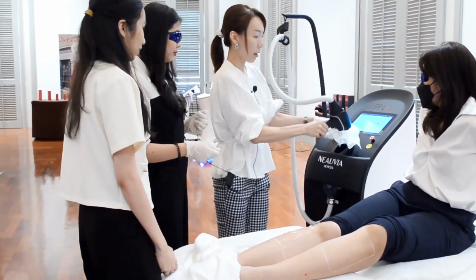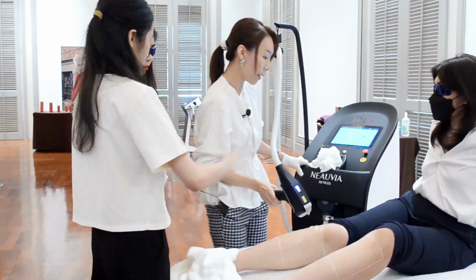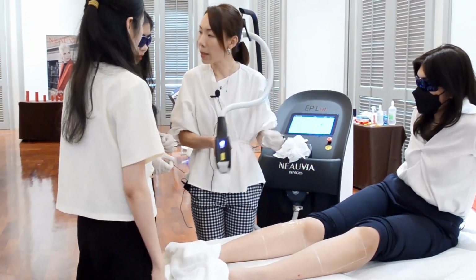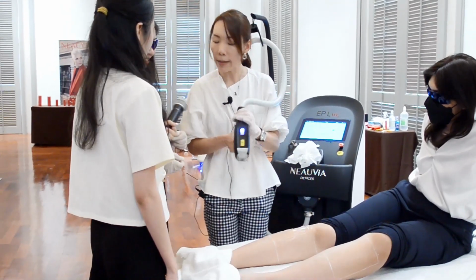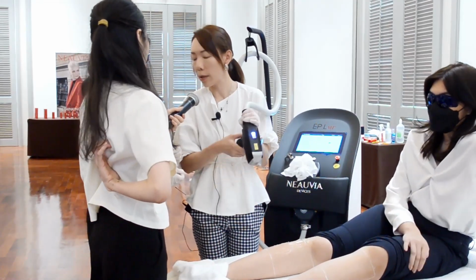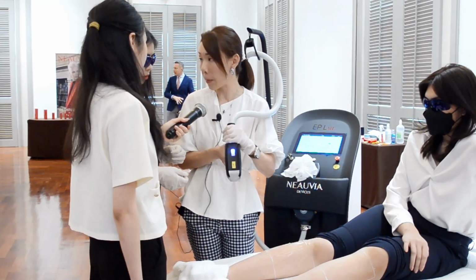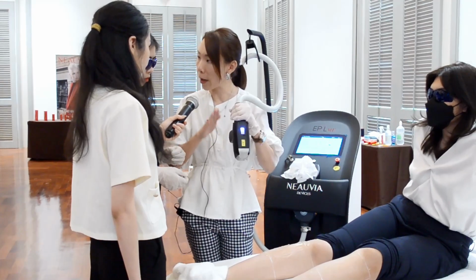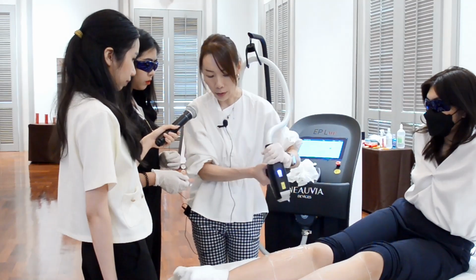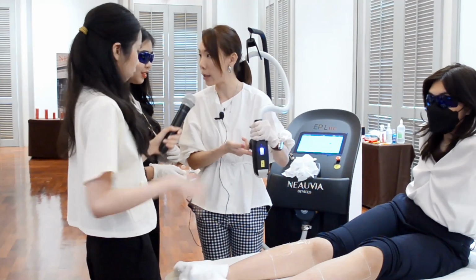So what I meant is that you don't need to start first. Chutima, can you sit over a bit more? Thank you. So use 2 hands for more stability, because it is heavy. At all times, this device has to have full contact with the skin. If it's too heavy, when you're moving, you might glide off and the patient might feel burned. When you're doing application, you also have to have some pressure on the skin area. So you use 2 hands and glide first, and then if you're very comfortable with the motion, you will press this button to start the treatment.